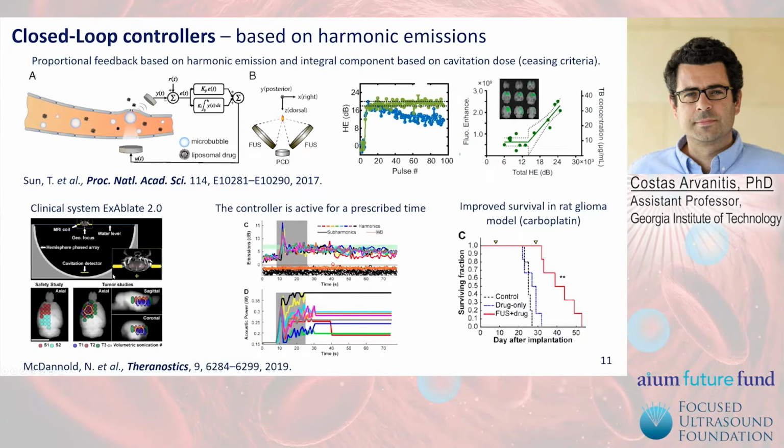Likewise, this method, using only the proportional part and not the integral part, has been tested using the Exablate system by McDonald et al. and using a custom-built passive cavitation detector. In this implementation, the controller tries to reach a predetermined level and maintain that level, as you can see in this plot here.